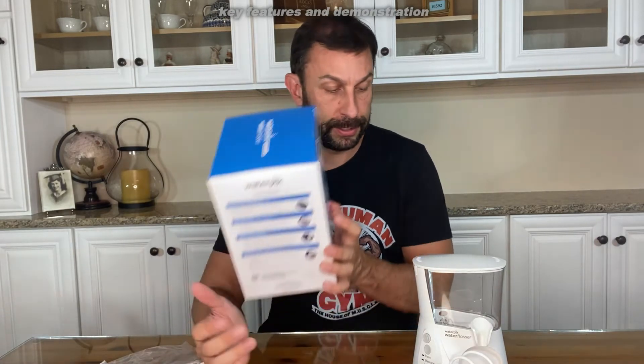It says healthier gums and brighter teeth in just one minute per day. High volume covered reservoir, mode button, LED display, and the tip rotates 360 degrees. It's really an easy device. If you're looking to improve your gum health and keep tartar, plaque, and everything else from building up, this may be the device for you. The price is fantastic, easy on and off — just get between them teeth and you're going to love it. It actually feels very relaxing.